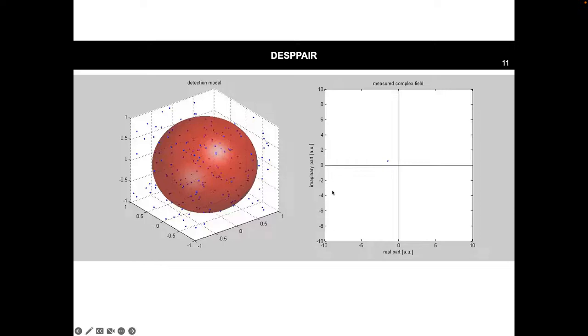What you may have to keep in mind is the intensity profile of the beam. This is now X. This is the intensity profile. That's going to shift, of course. So which part is that? What's going to shift then? What is going to change in this vector in X, number 110? Because it's at the edge.